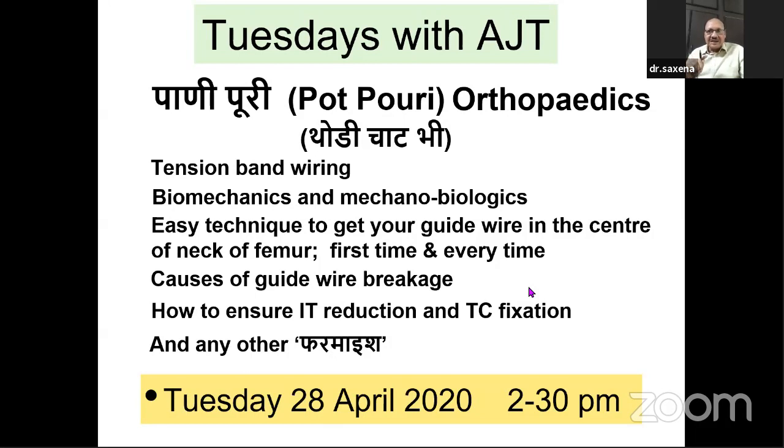As far as the dressing is concerned, he suggested a very nice way of putting gauze all around the pin. What I do is put a rubber cap, which is available from injection vials, mounted over the wire and taken up to the skin. In between, we put just a betadine gauze or a simple gauze, and that takes care of the dressing. So that's a very easy way of putting a dressing in the Ilizarov, and even around other fixators where the pins are going inside, this sort of dressing can be done.